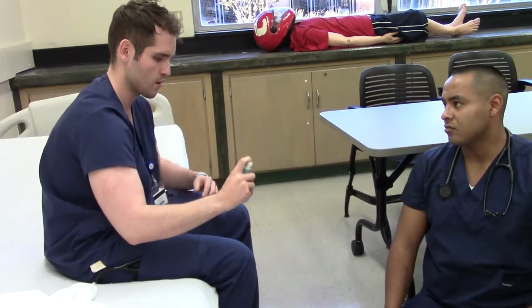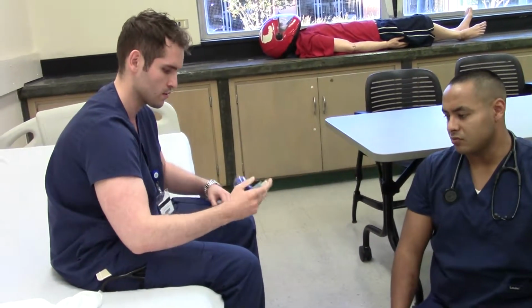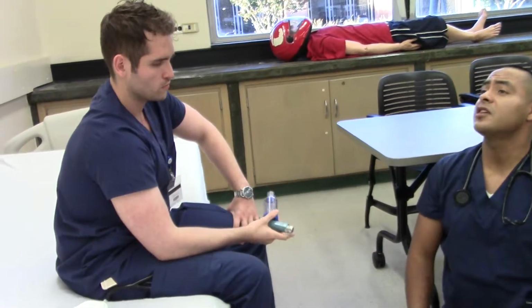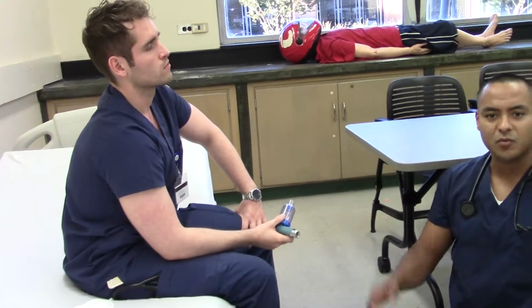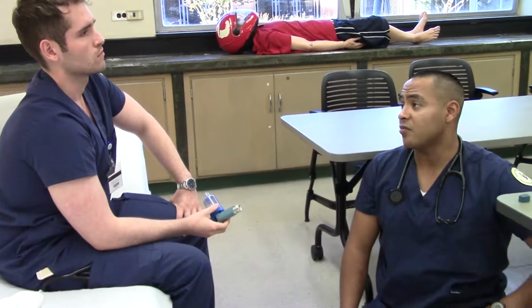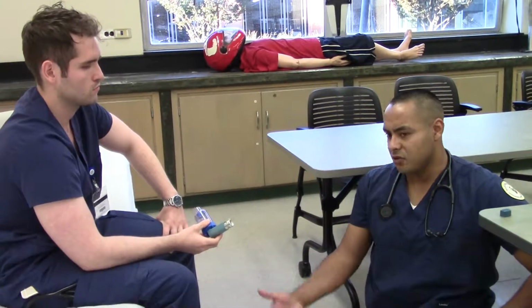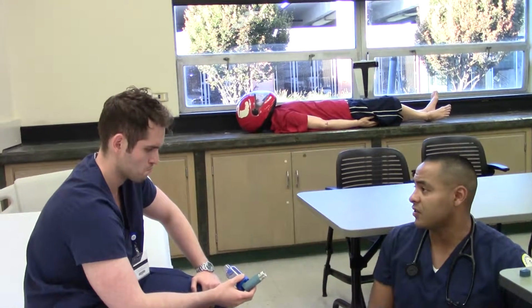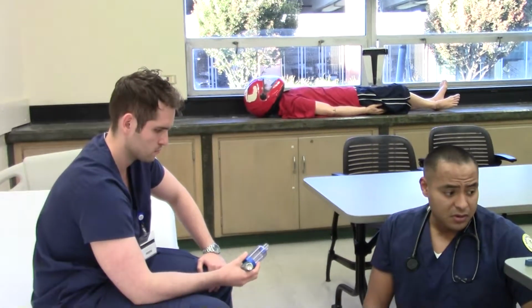So I'm just gonna go ahead and try that real quick. Good. Press it. Boom. You look up a little bit. Try to hold it 10 seconds, if you can't, just do as long as you can, then breathe out through your nose. You take two of these. You want to take 2 doses of that, okay? Okay. Cool.